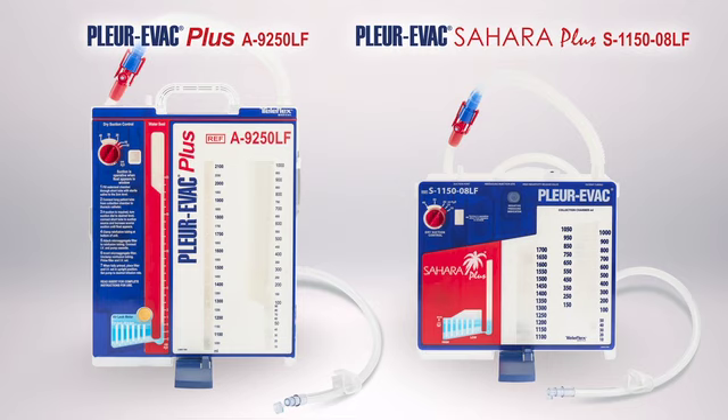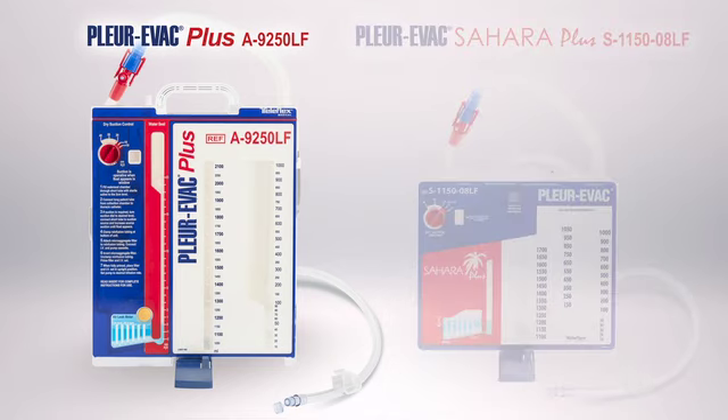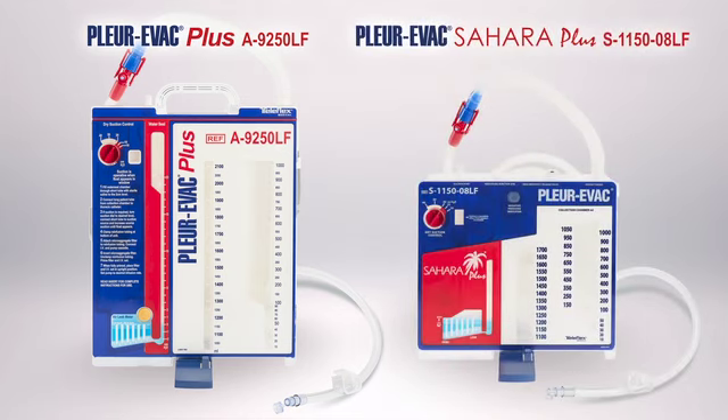Both systems are designed to offer the option for collecting and continuously re-infusing autologous blood without a bag. In this video, we will primarily discuss the A9250LF given its prevalence in the market. At the end of this video, we will briefly mention the differences found on the S1150-08LF.